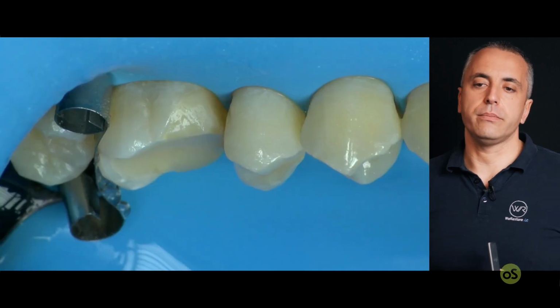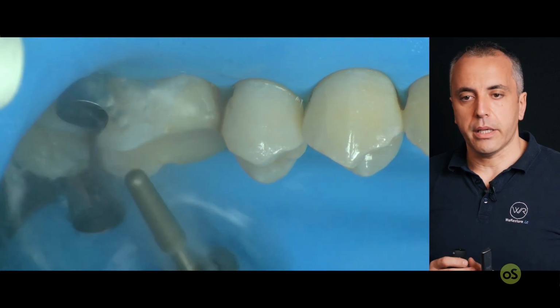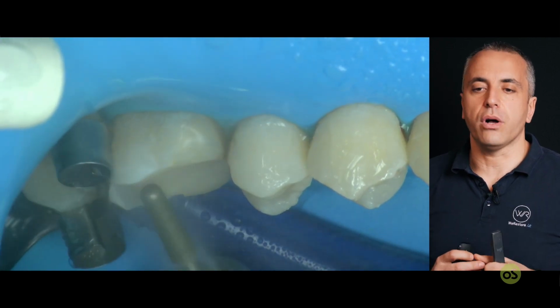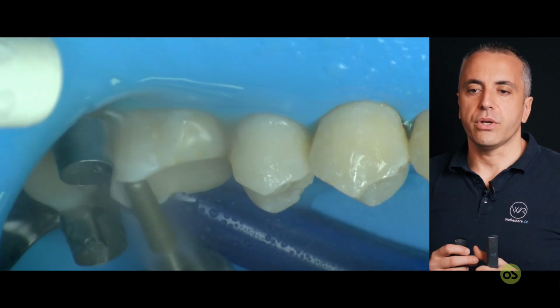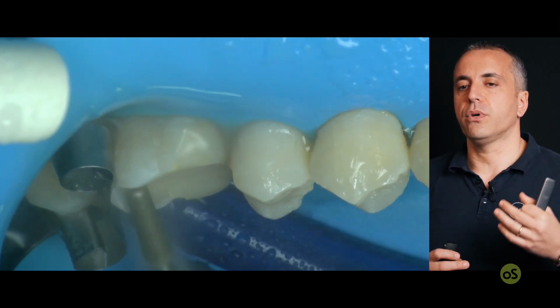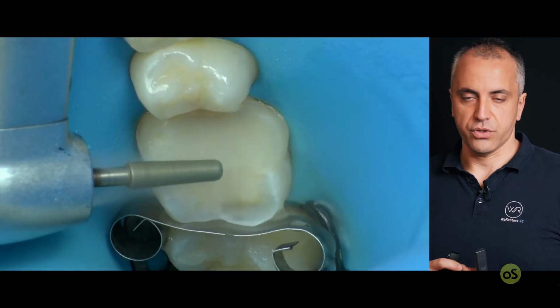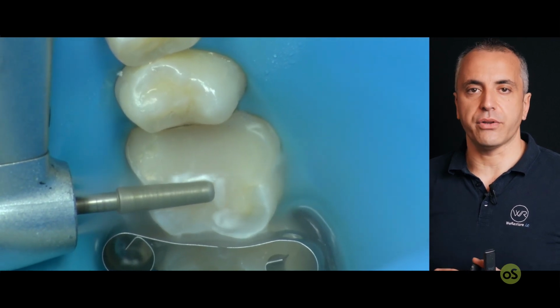Always having the opportunity to check the thickness of the preparation is something very nice. On the interproximal area between the 7 and the 6, there is the interguard, which is a protection. It's quite tight and strong. It's nice to work with. We know the thickness of this burr, and so we know how to go inside the tooth structure in order to reduce. So if you want to reduce, for example, 0.5, 1 millimeter, 1.5, like in this case, you choose the correct size and diameter of the burr.